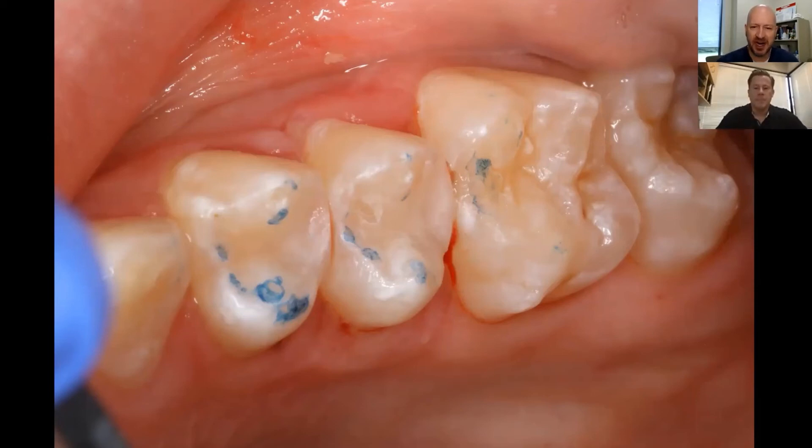I'm struck by your blending of the composite — even when it's dry here, the color match looks really great. Even zoomed in close to the teeth, it's very difficult to see where the restoration is and where the natural tooth begins. There are a lot of nice composites on the marketplace, and many of them are going toward a one-shade universal type system — whether that's good or bad is debatable. But the composites we have today are fantastic. The blendability, finishability, and polishability of these materials is really second to none right now in composite dentistry.